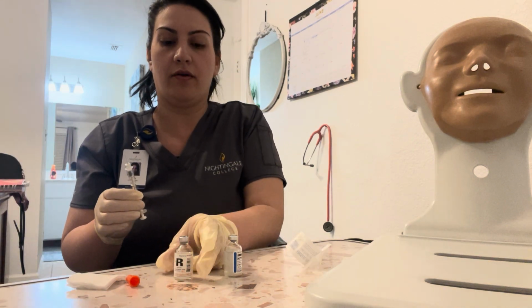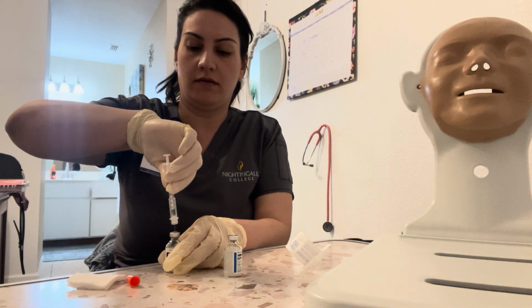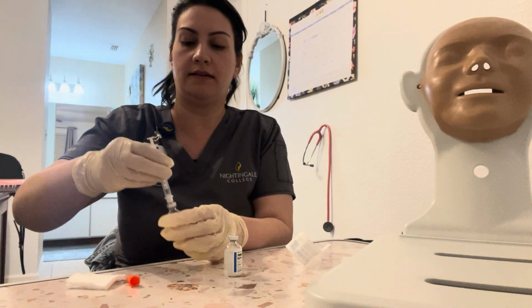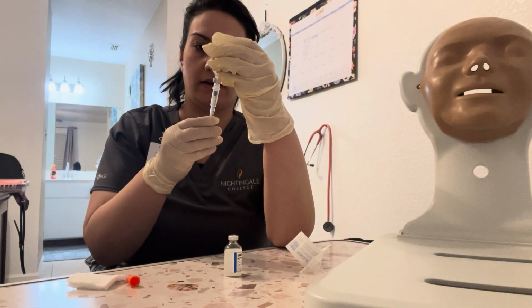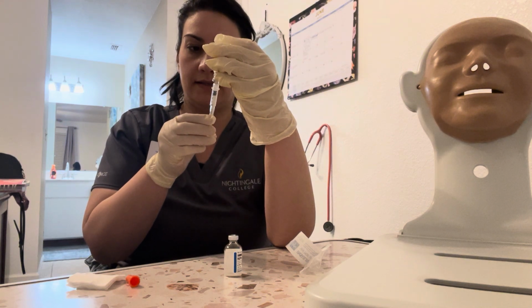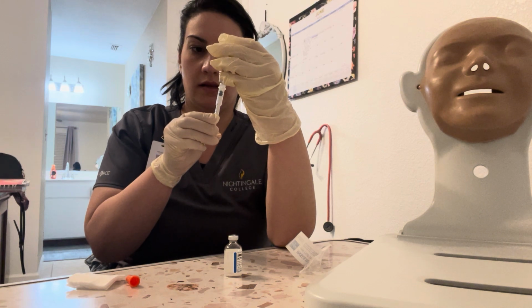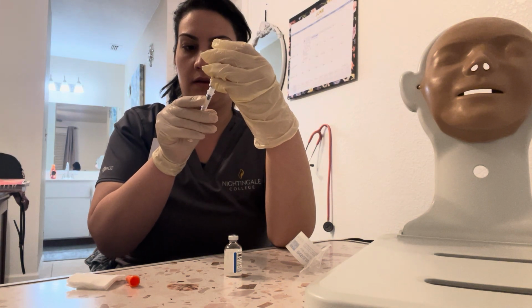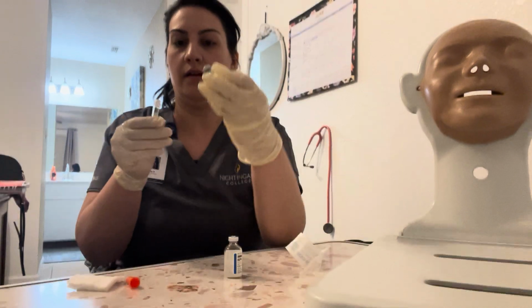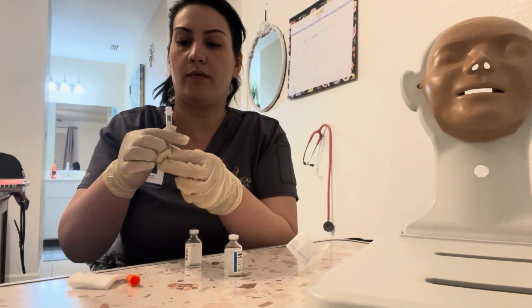And then now I'm able to draw up the solution. We're going to inject that air back in there. We're going to hold it like a pencil. We're going to draw up 4 units of regular insulin. I'm going to tap for any bubbles. Nurse and I verify against the MAR, 4 units of regular insulin.